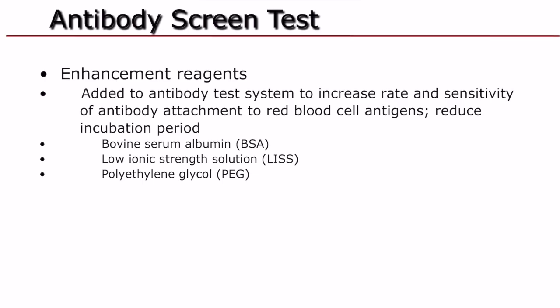Enhancement reagents. So we have talked a little bit about enhancement, and what it accomplishes is it enhances the reaction. Decreases the incubation time, thank goodness, right? But what it does is it increases the rate and sensitivity of the antibody attachment to the red blood cells.